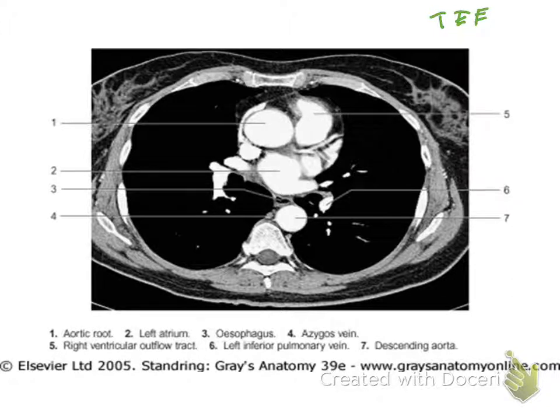This is if you have the device pointing anteriorly. But if you use the same device and rotate it, then you're going to see posteriorly, where you're going to see the aorta, and anteriorly all those that I mentioned. What I want to show you in this picture are some organs that we should know. This is your anterior, and this is your posterior.